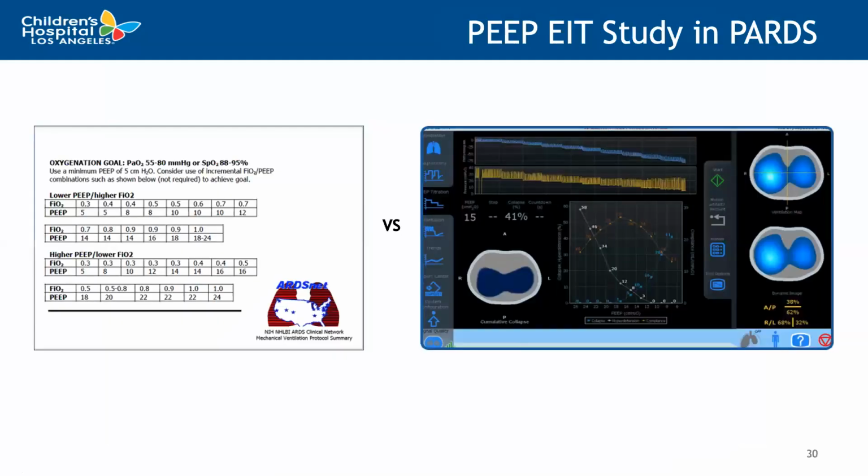So this is a really exciting new tool and way of managing PEEP in ARDS. We're actually conducting a trial right now at Children's Hospital Los Angeles, in which we're comparing the PEEP strategy based on EIT to the more traditional gold standard of the ARDS PEEP FiO2 table.